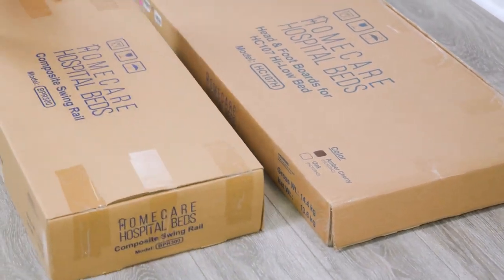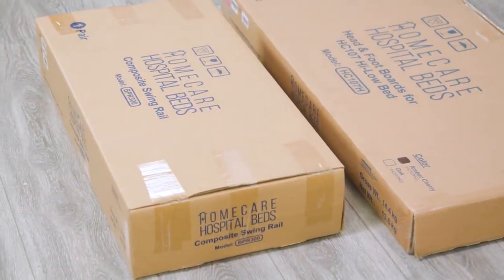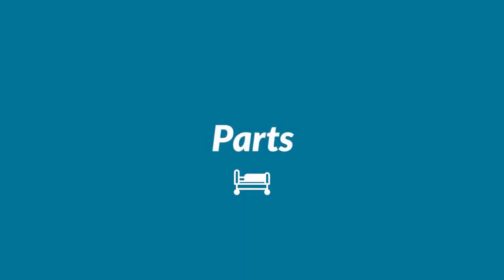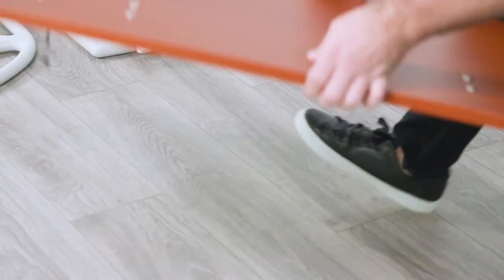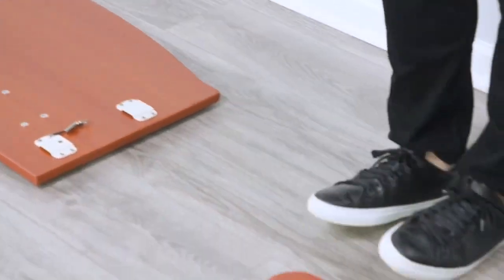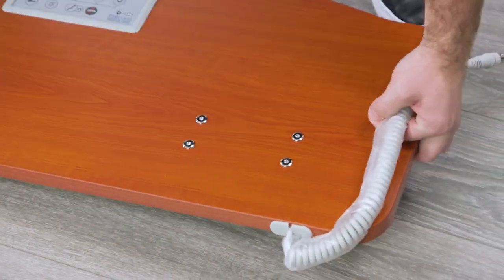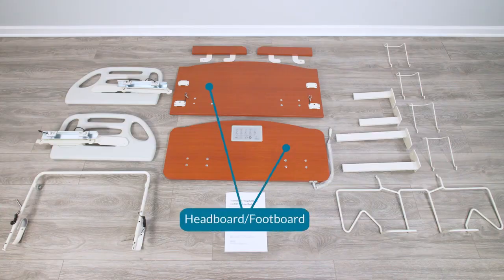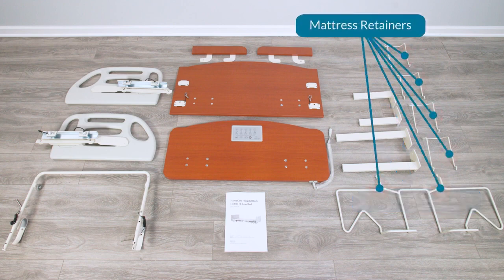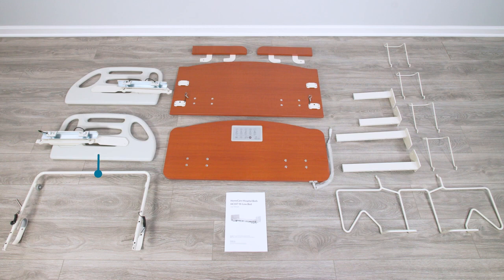Remove any remaining packaging material from the bed and take all parts out of the box while checking for damage. Lay out the individual parts on the floor before beginning assembly. Make sure that you received all parts, including headboard and footboard, headboard and footboard frame mounting brackets, width and length mattress retainers, wall bumper bar, and side rails.